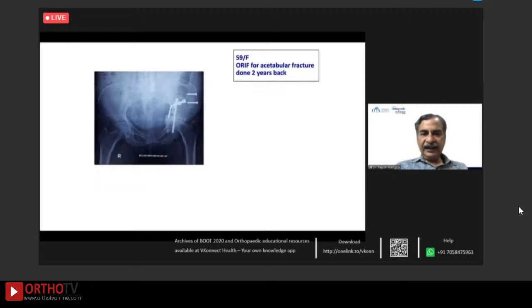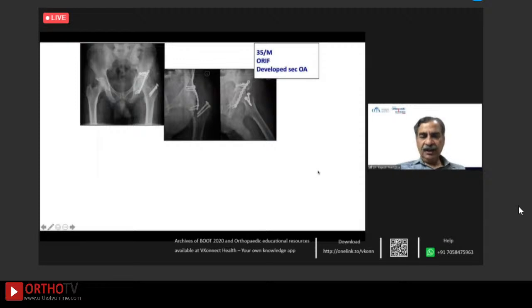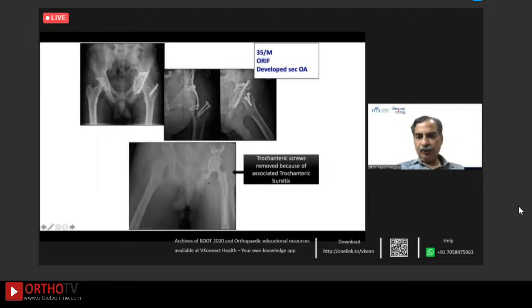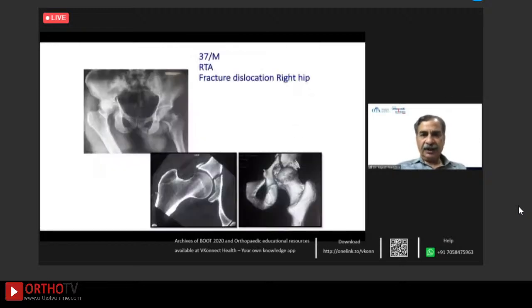59-year-old female, again, done 2 years back. And then you can see that only that hardware which is coming in the way is removed. And notice these screws in the pubis and ischium, which have to be put in. Another example here, and you can see the trochanteric screws had to be removed here because they were a cause of recurrent bursitis. So they were done away with, and the surgery was done, and this is the follow-up.